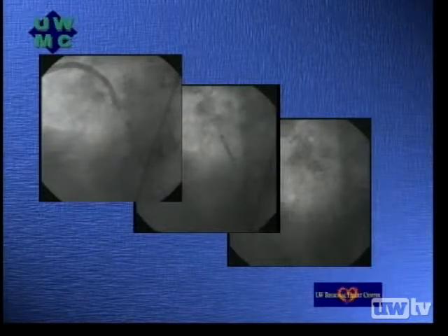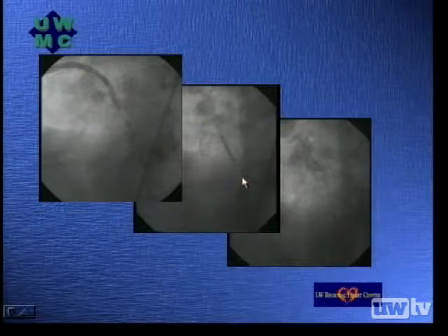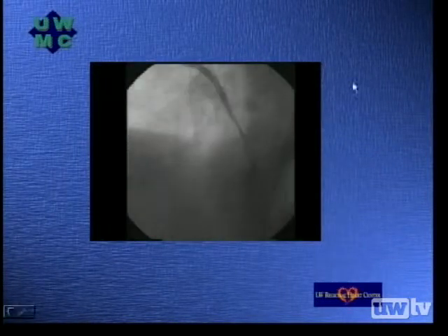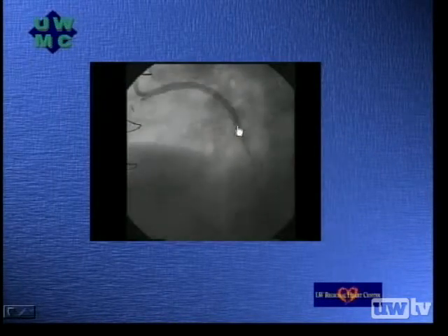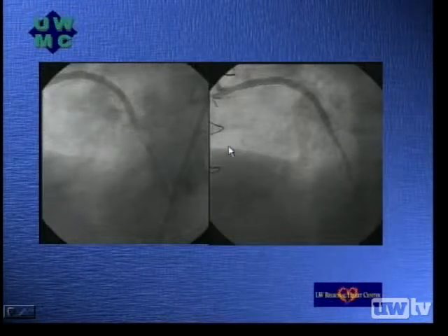We then turned our attention to the saphenous vein graft site, where you can see the stenosis at baseline. Here is, again, a cutting balloon, this time a 3.75 millimeter balloon, and the radiation source you can see right there. Again, delivering 18 gray to the vessel wall over a 3-minute span of time. Here's the angiographic result after we were done. Here's the area of the stented portion right there. And here are the before and after pictures.